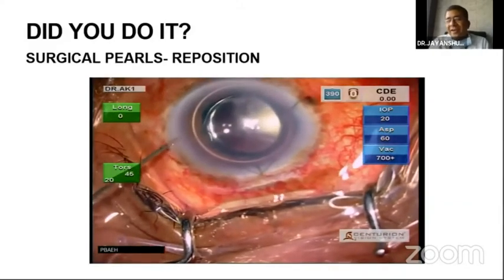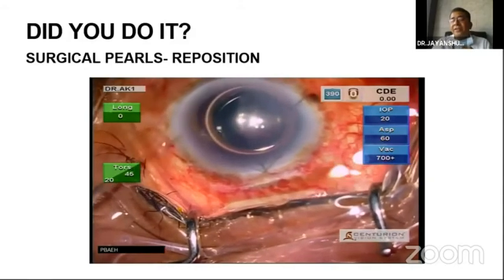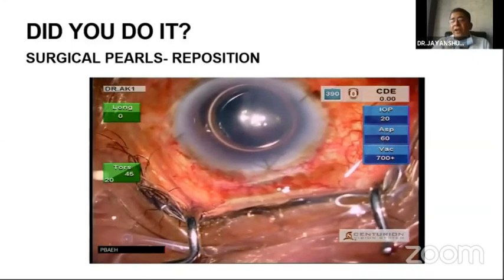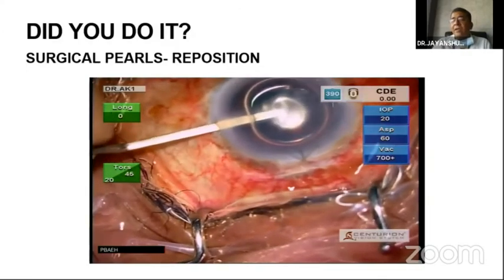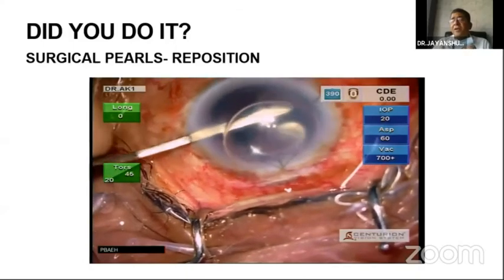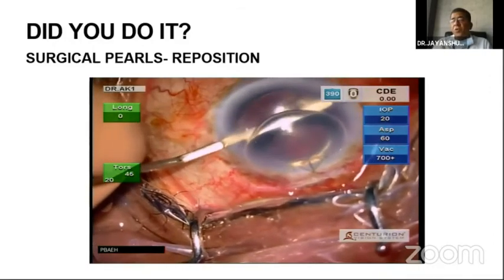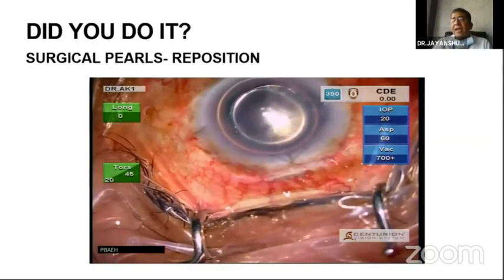You have to understand that in the videos it is not always possible to demonstrate that scroll, because it's a two-dimensional image that we are getting. But on the microscope you have to have very clear visibility, and it is very important to use topical glycerin during this procedure, or debride the epithelium, to increase your visibility, because we need to be bang on, we need to not injure further in this situation.